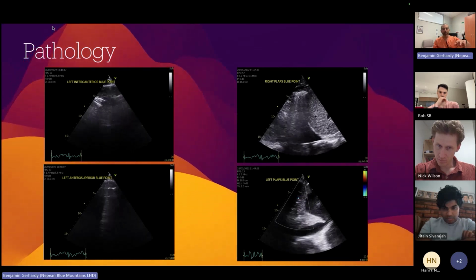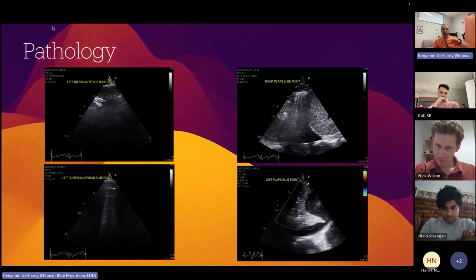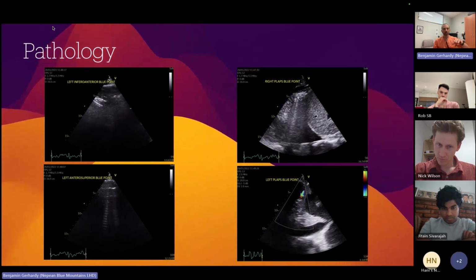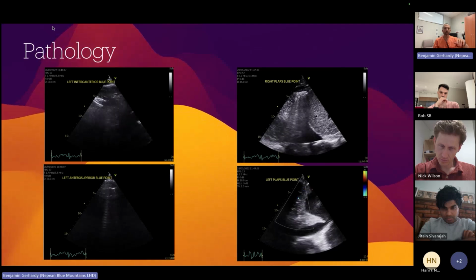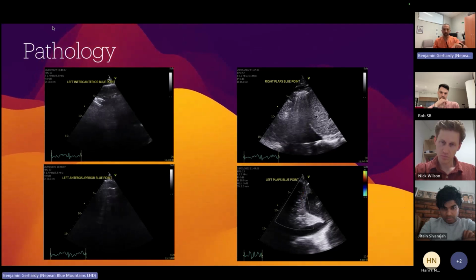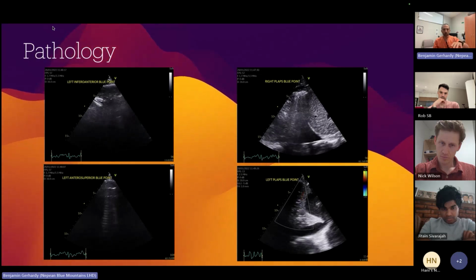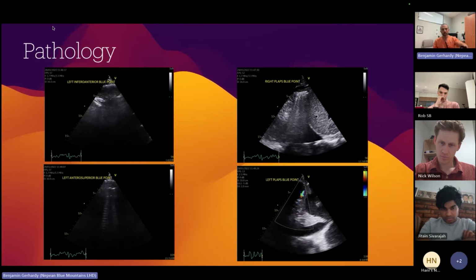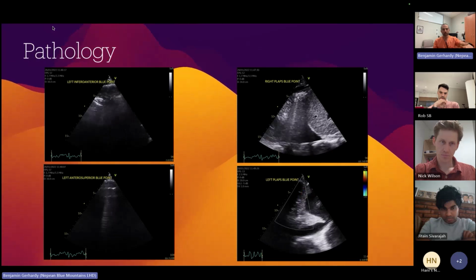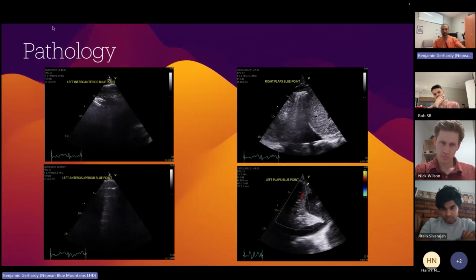Sorry about that. But you can see at the very top of the sector, the pleura is moving back and forth as the patient's got a respiratory rate of 30 or 40. They're puffing away. You can see the B lines flicking down. They're destroying what's beneath them. They're going down, not quite to the bottom of the sector here, but that's because of the depth and the TGC has been pushed really far back at the base. But you can see they just keep going down, down, down.